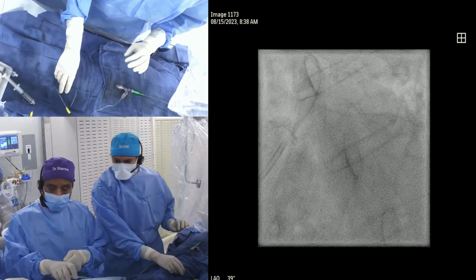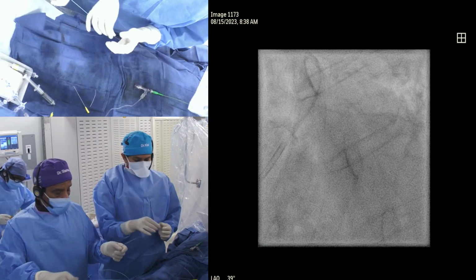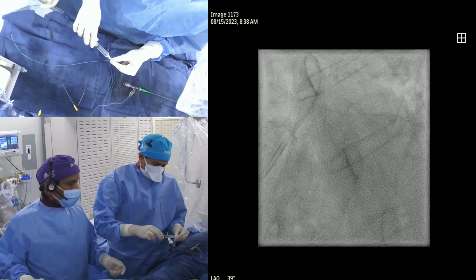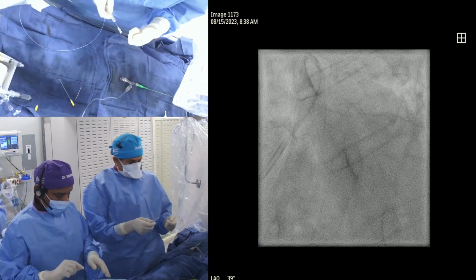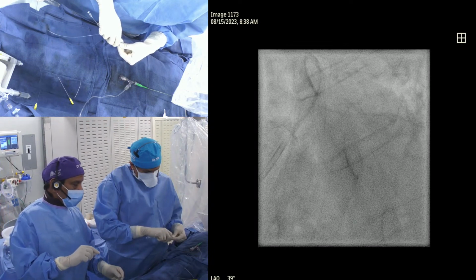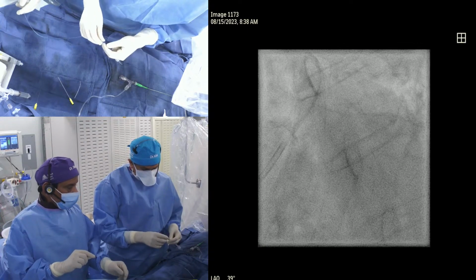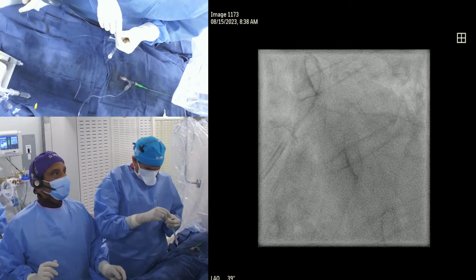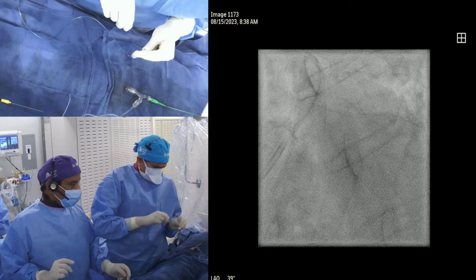I mean, there's the venture that will make a curve. There are other catheters also. Other techniques which have been referred here are Gaia, reverse wiring, pilot. So lots of people are responding to a challenging case. Yes, excellent. That is precisely the purpose of this interactive session. And as I had pointed out in the beginning, hopefully with many teaching tips today.